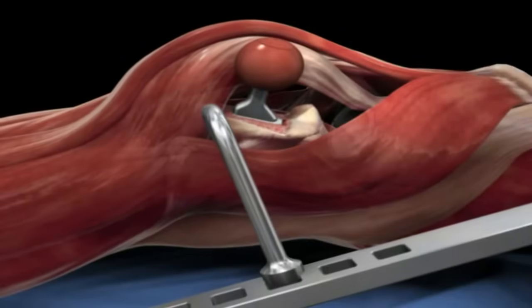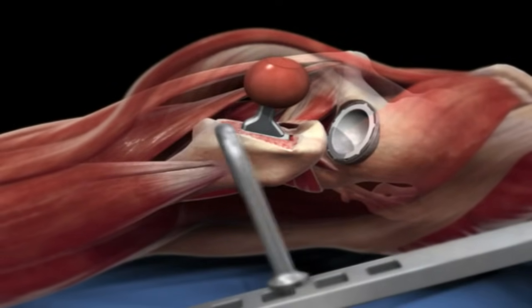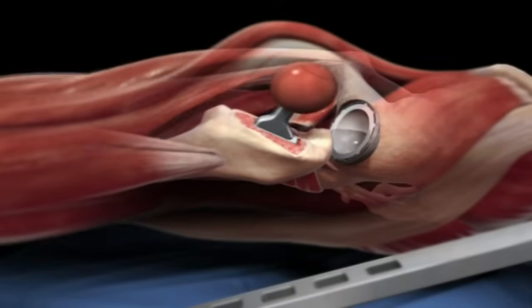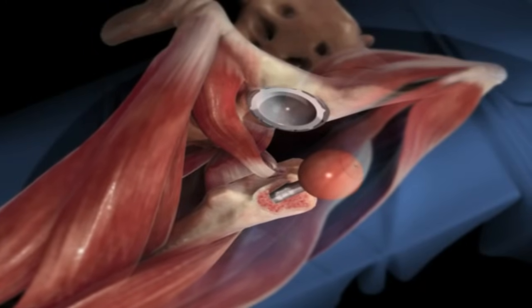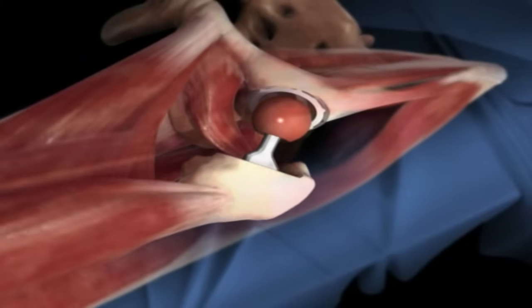At this point the ball and socket joint are put back together so that the surgeon can put the leg through a range of motion and test it for stability. Also at this time an x-ray is brought in to allow the surgeon to check leg length and fit of the prosthesis.